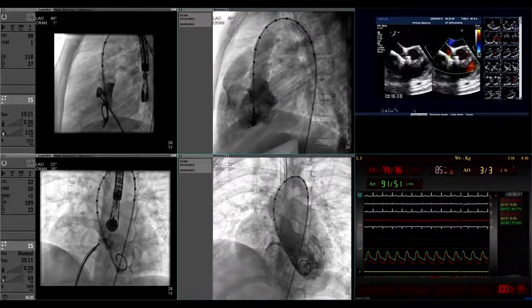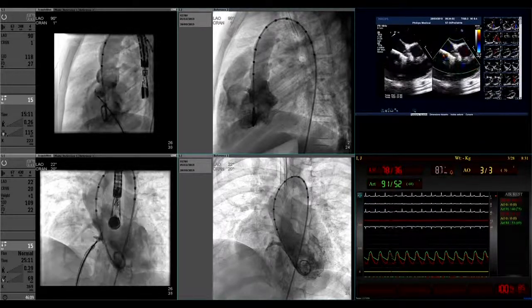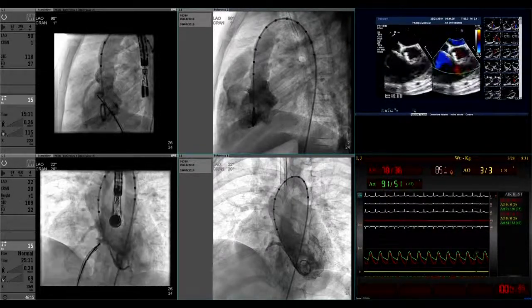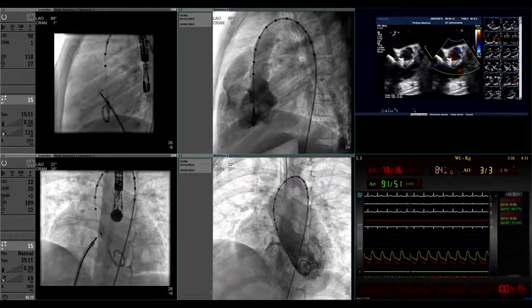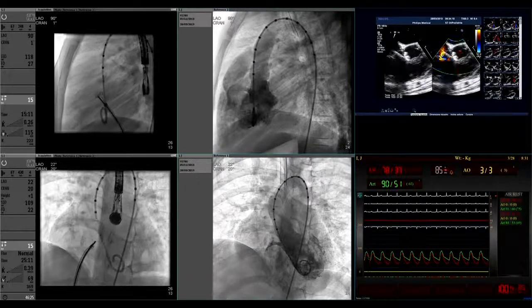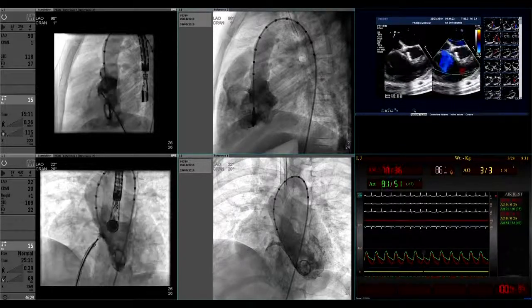So I think that Dietmar's point is well taken. If there is a mushrooming of the pulmonary end a little bit on the RV side, that means there is a waist formation on the device. Usually it's pretty stable. In this view below, that shallow LAO cranial, the PA end is really looking bulged compared to the waist of the device. So I think it's reasonably stable.